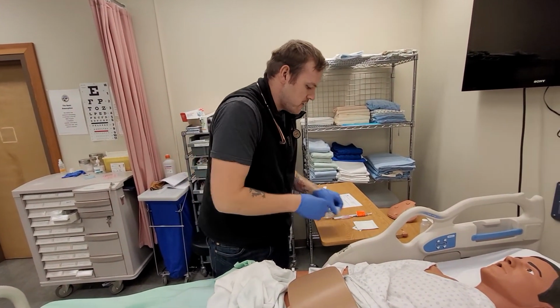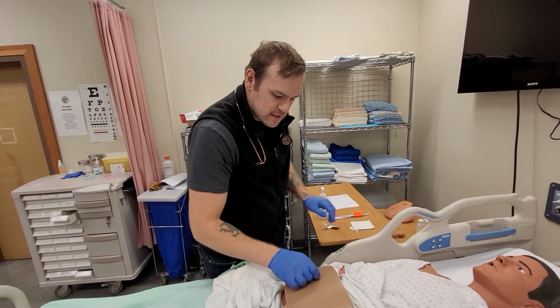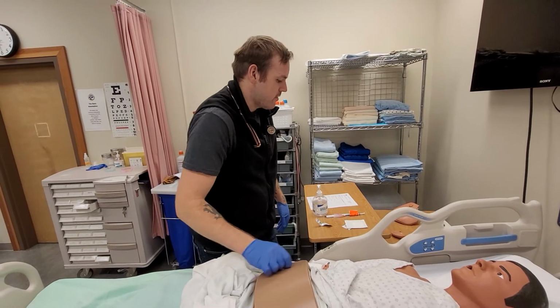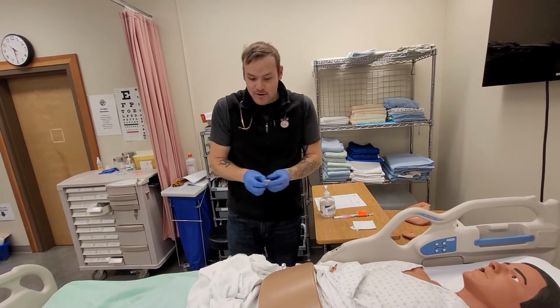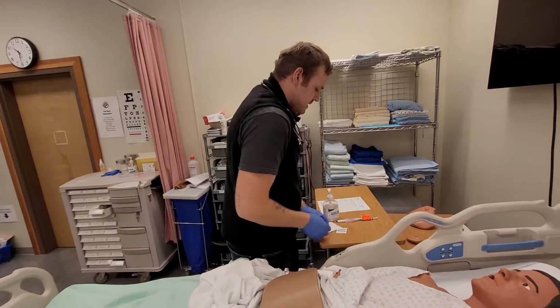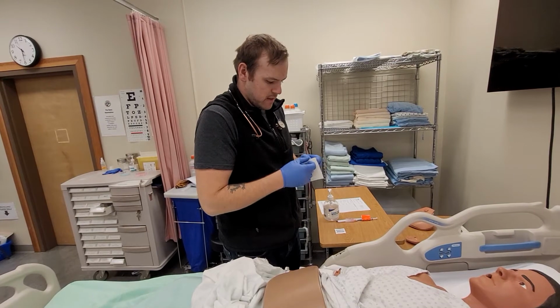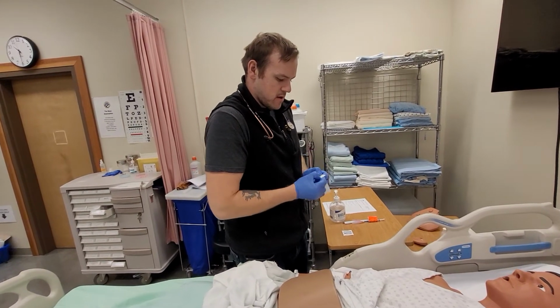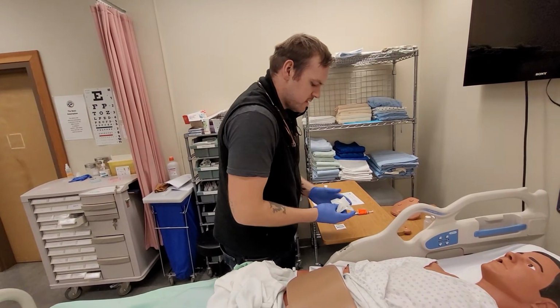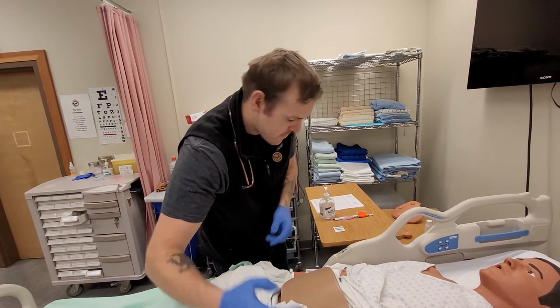And we're going to clean the area with an alcohol swab. We're going to do it for 30 seconds. So we've done that now for 30 seconds. We're going to let that dry. I'm going to prep all my supplies that I'm going to need. That'll be the sterile gauze to apply pressure should there be any bleeding afterwards and encourage clotting. Put that right here. Okay.